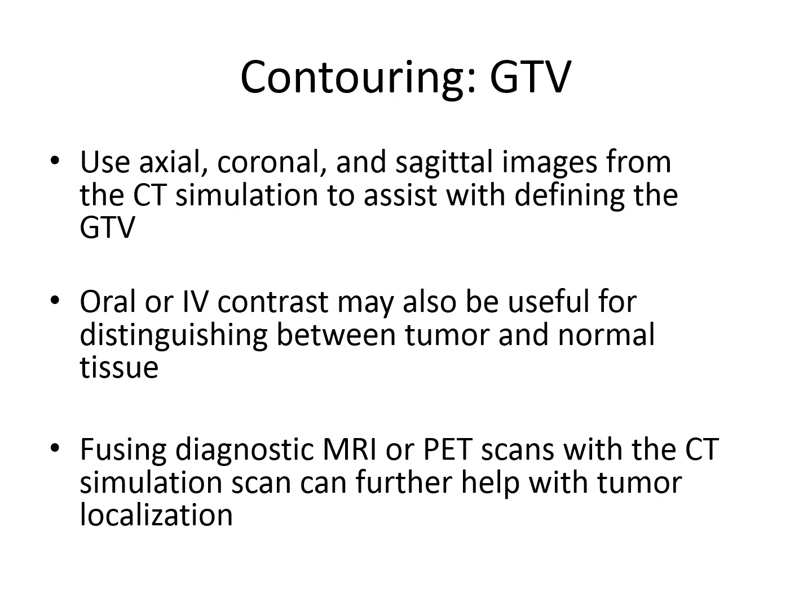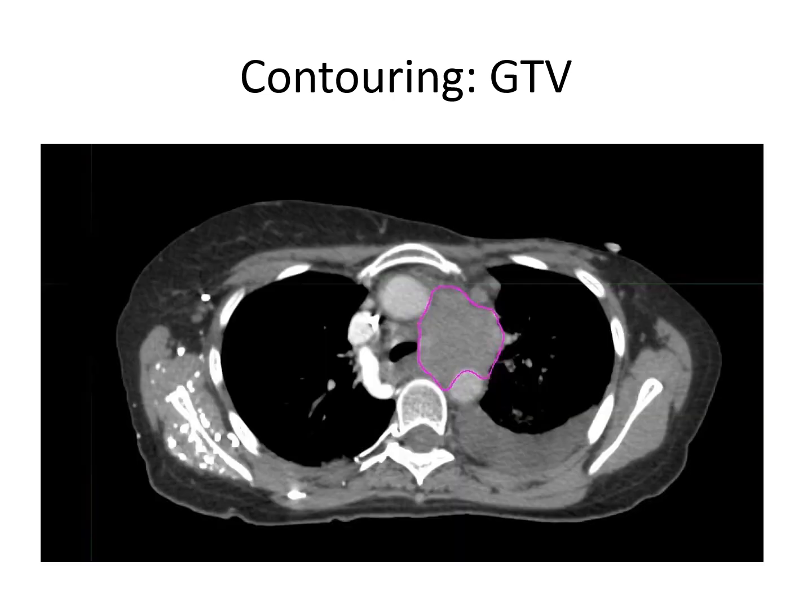When contouring the GTV, use the axial, coronal, and sagittal images from the CT simulation to assist with defining the GTV. Oral or IV contrast may be useful for distinguishing between tumor and normal tissue. Sometimes fusing diagnostic MRI or PET scans with the CAT scan simulation can also help with tumor localization. I have outlined the gross tumor volume evident on this particular slice, and you can see that the gross tumor abuts the airway as well as the vasculature.